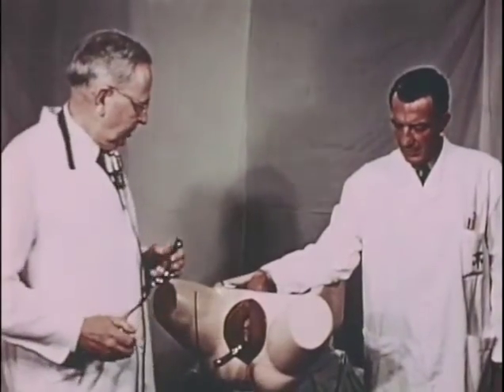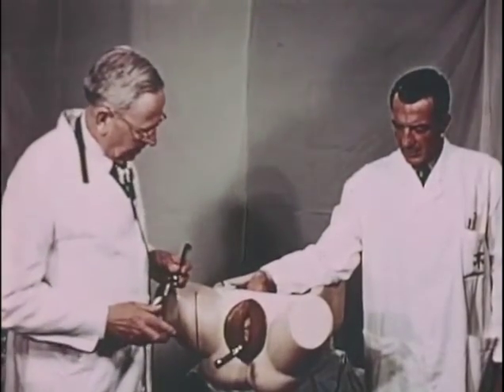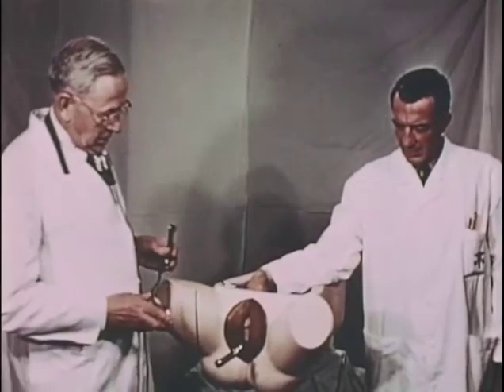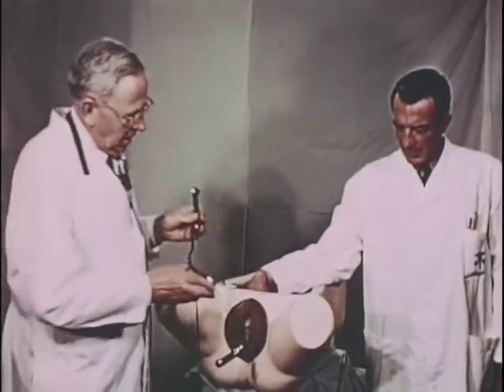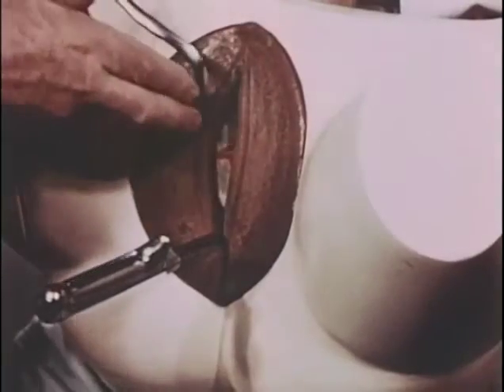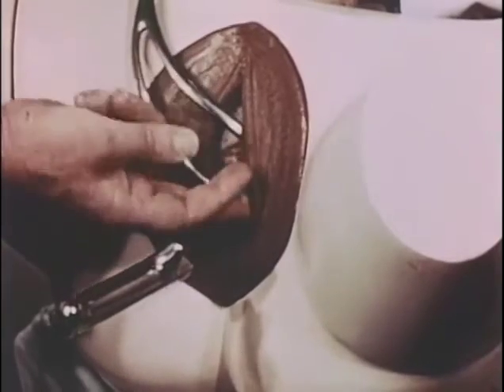Then the operator shifts to the opposite side for the introduction of the anterior blade. The left blade, the handle of which is held in the left hand, is introduced to the left side opposite the baby's left ear.